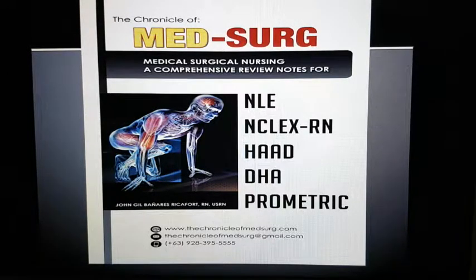Okay, so I hope that before you play this video clip, you're able to watch the previous videos that have something to do with an introduction about the cardiovascular system, wherein I mentioned the different waves in your ECG. For this clip, I'll be teaching you how to read the heart rate of the patient in your ECG strip. So just an overview.